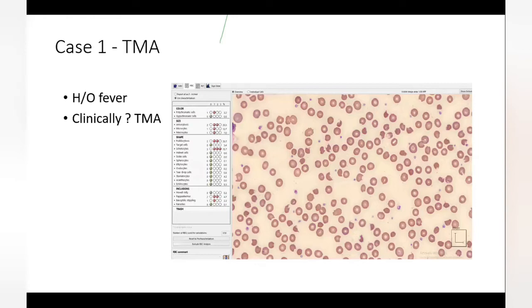So if that's how strict our guidelines are, then just imagine. This is one of my first cases to show you, because I know in my practice that although fairly good pathologists are always able to identify schistocytes, the repeatability is always very poor. Trying to quantify schistocytes and give your clinician a report saying there are 2% schistocytes or 1% schistocytes is not always repeatable, not always easy, it's very challenging, and the poor repeatability can lead to poor decision making in the clinical setup.